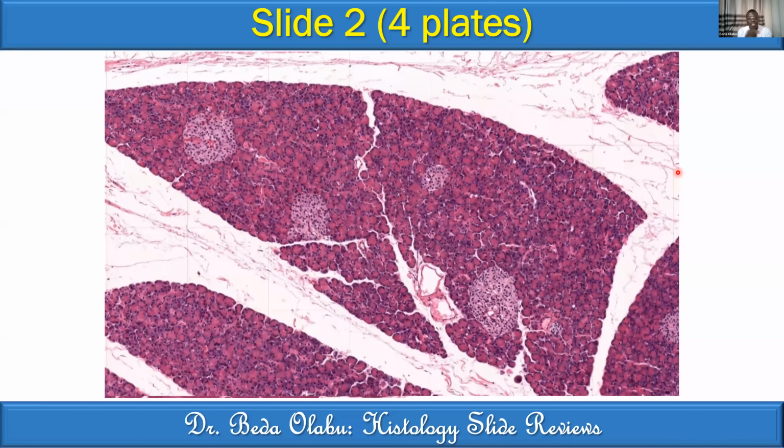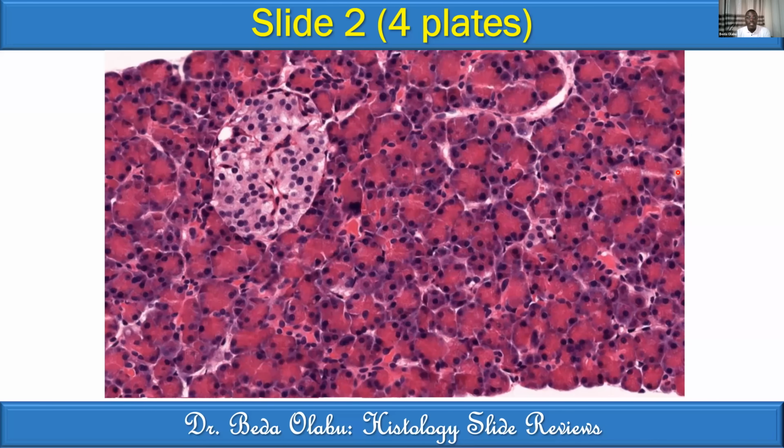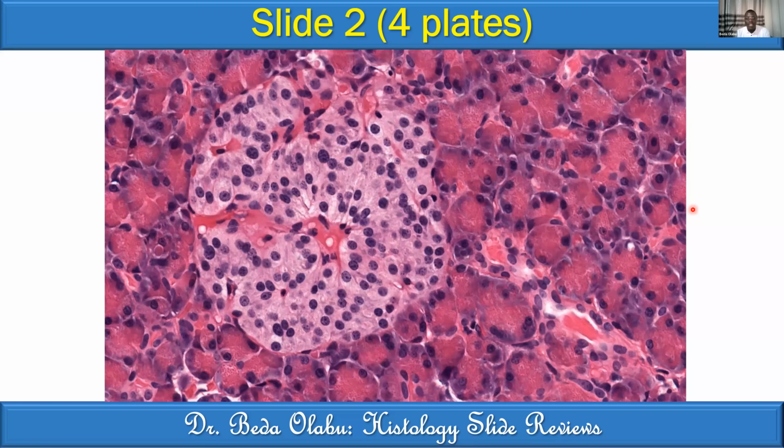Right, let me give you a third level of magnification. That is the third level of magnification. Just put down what is new. And finally, that is the fourth level and the last level of magnification. Just write down what's new.